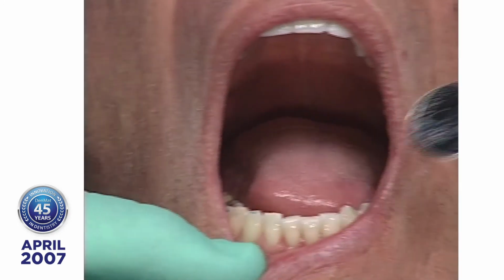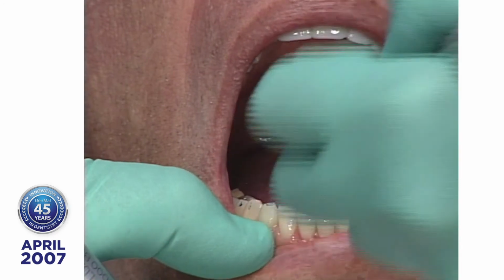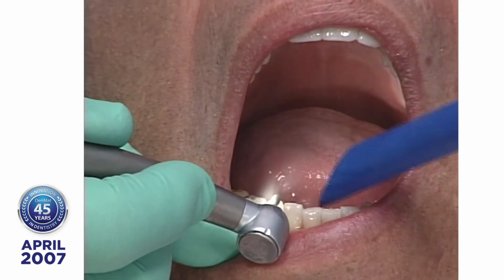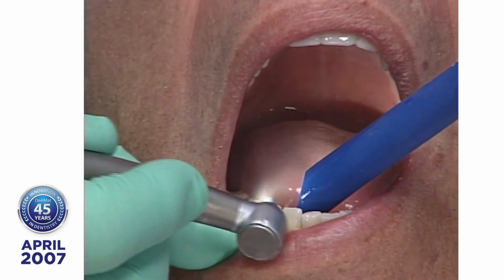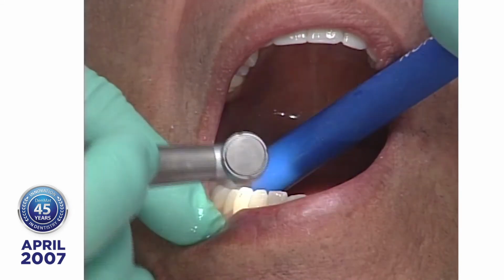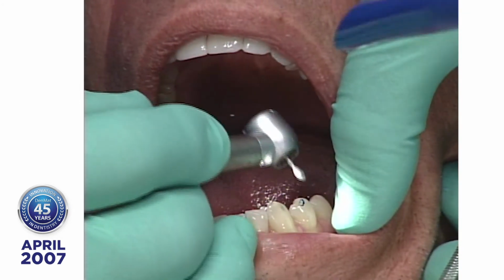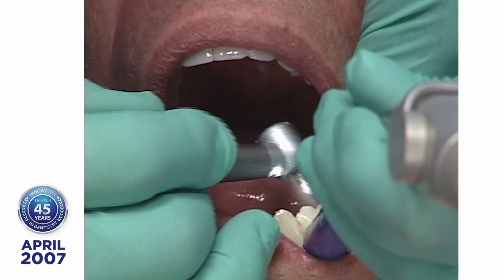Oh, look at this mandibular cuspid right here. It doesn't look like a heavy mark, but that's wanting to knock off that lateral. So no matter how much you know about occlusion, if you don't apply it on the installation, you can miss something and then have the patient get a little fracture. So we're going to relieve those now with the football-shaped diamond. We want to get these inclined planes removed so we have points of contact.